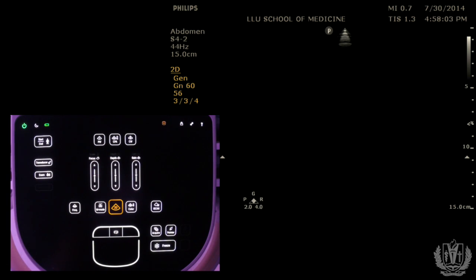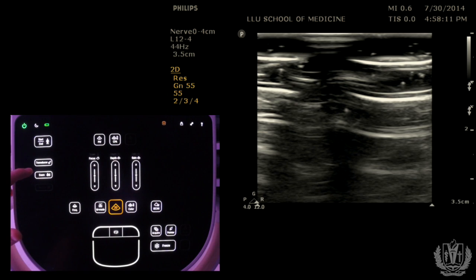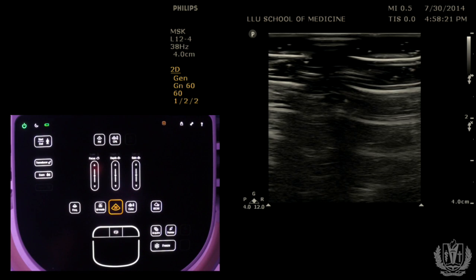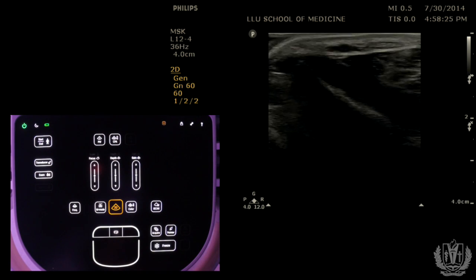After you pick the correct probe and the correct preset, you're going to start scanning. We're going to do a sample scan of a forearm using the linear probe with a musculoskeletal application, and we're going to look at the radial artery.